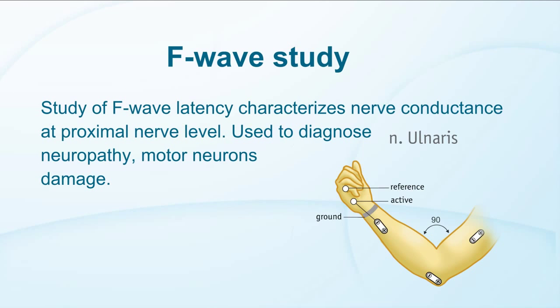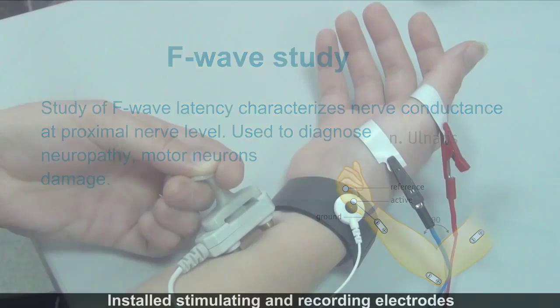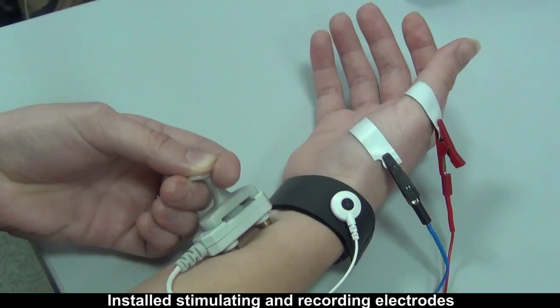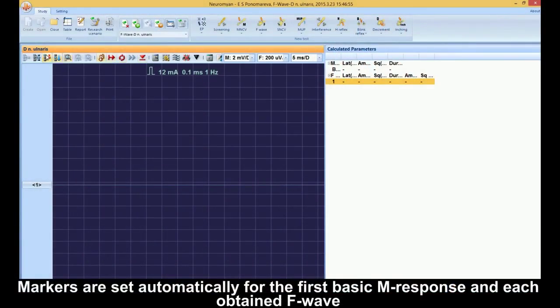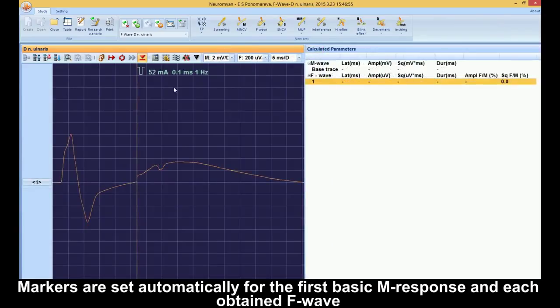Study of F-wave latency characterizes nerve conductance at proximal nerve level. F-wave is usually recorded after MCV study. Therefore, the stimulation points, record points, and stimulus level are already detected.